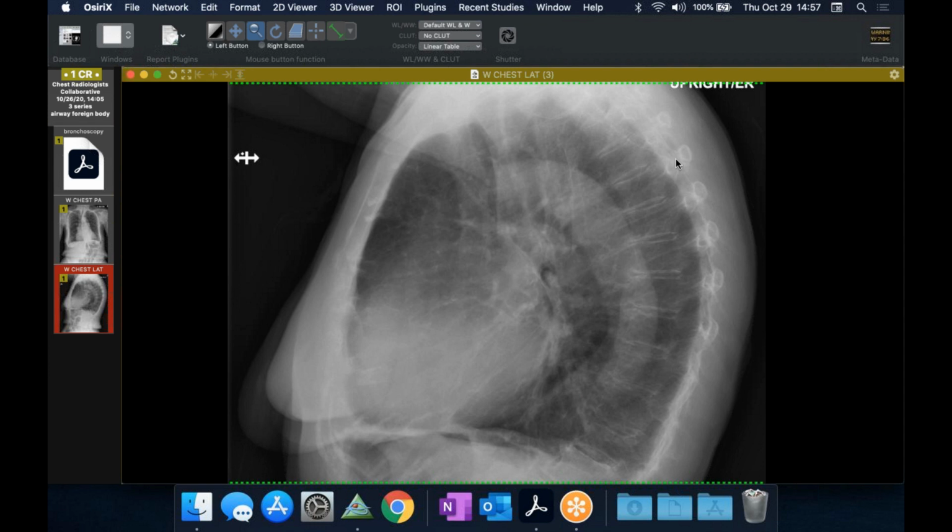So I managed to talk them out of a CT because it's compelling and it's in the right place, and pulmonary was fine with that. So they ended up doing a bronchoscopy to pull this out because it clearly looked like one of her potassium chloride tablets. And it's rotated. Let's see if I can rotate. I can't, but that's all right. You can see it there. There it is, just sitting right in the airway. And you'd think these would be easy to get out, but it turns out it took them a little bit of time.